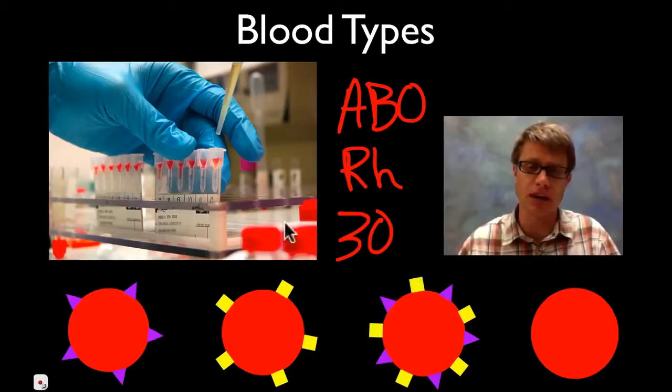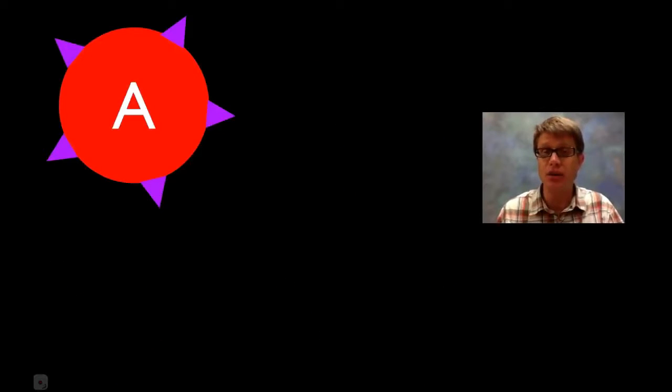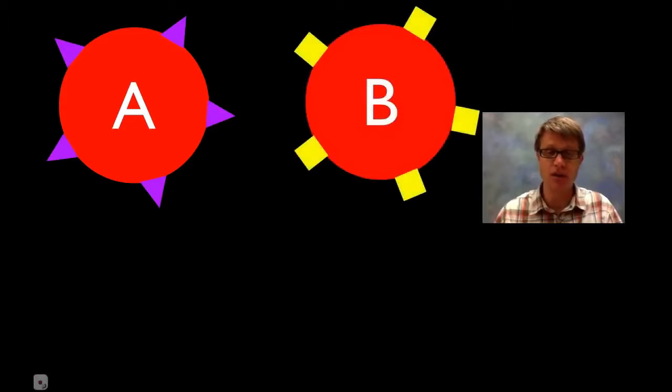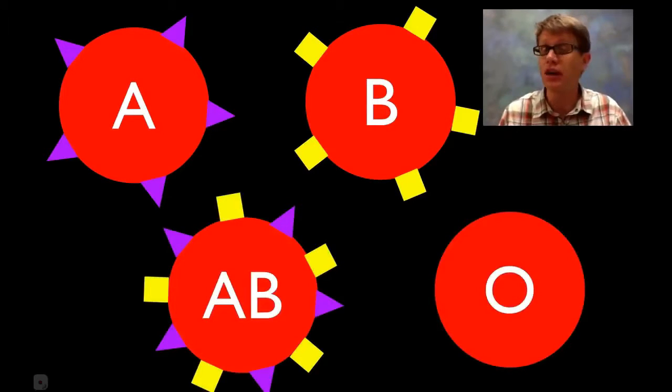And what are we talking about when we're talking about blood types? Well, basically, we're talking about proteins that are found on the surface of our blood cells, or our erythrocytes. And so basically, if we're looking at the ABO system, if you are type A blood, which I happen to be, that means that you're going to have an A protein, or a specific protein on the surface of your blood. If you are type B blood, then you're going to have a B protein on the surface of your blood. And this is just a comic version. They're going to be really, really tiny. You wouldn't be able to see them. They're just little proteins on the surface, or glycoproteins that are found on the surface of the blood. So if you have AB blood, well, basically that means that you have both types of proteins. And if you're type O, that means that you have none of these specific proteins that are found on your blood.